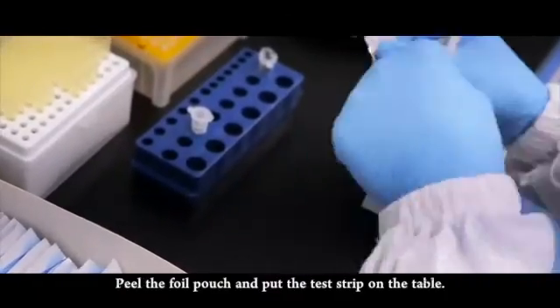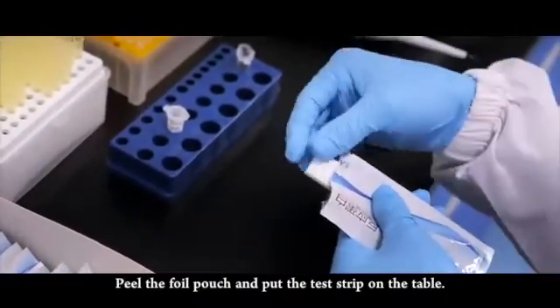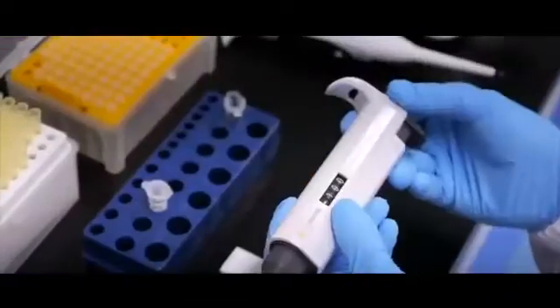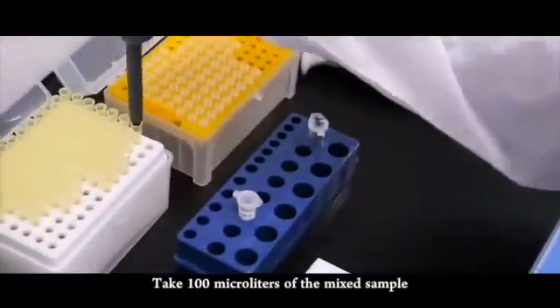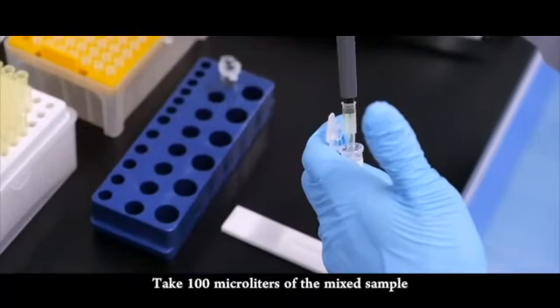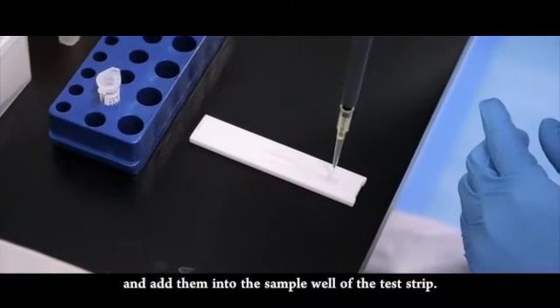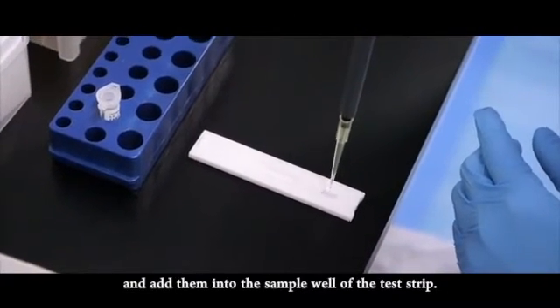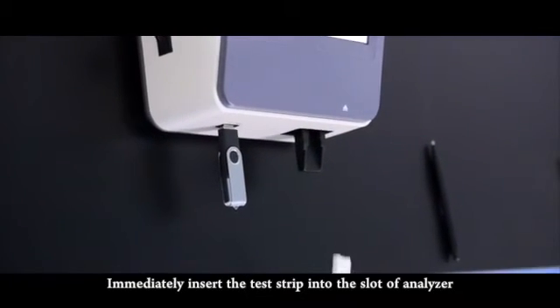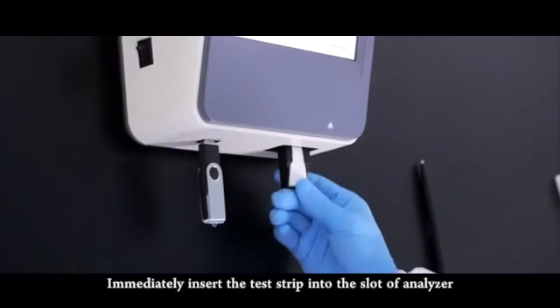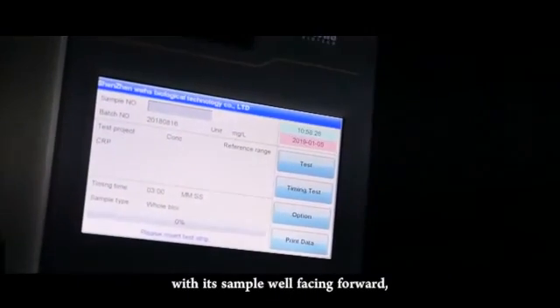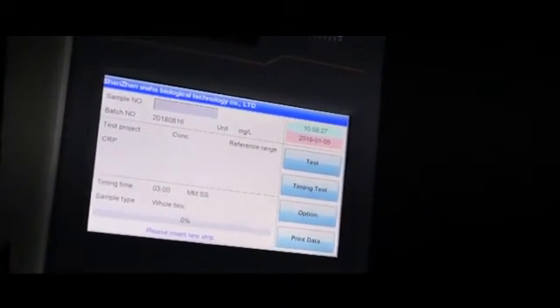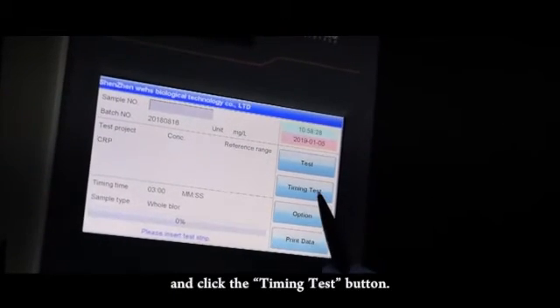Peel the foil pouch and put the test strip on the table. Take 100 microliters of the mixed sample and add them into the sample well of the test strip. Immediately insert the strip into the slot of analyzer with its sample well facing forward and click the timing test button.